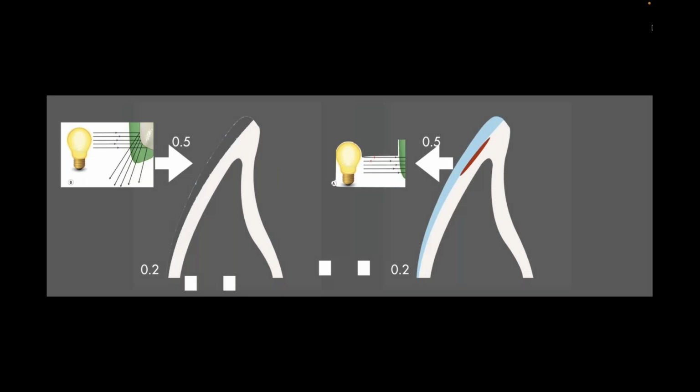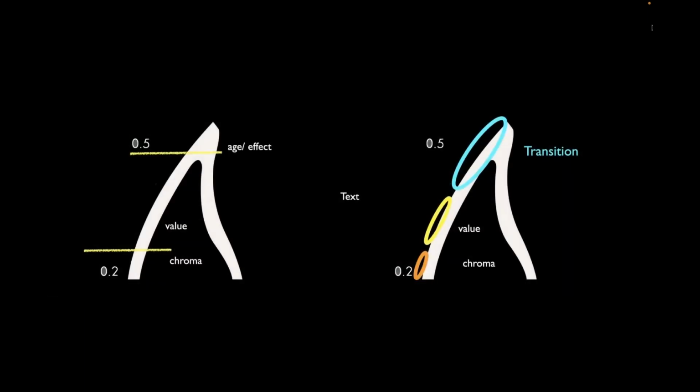So if I'm using something very translucent on my facial 0.2 to 0.5, a lot of that light is going straight through the enamel and hitting what's behind it. What's behind it may be a natural tooth, it may be your micro-layered crown, or it may be your fully built crown. I don't know, but I do know that I'm going to get a lot of that light transmission through it. If I use something with more opacity or more white or brightness to it in my enamel, then I'm not going to get as much of the light going through. I'm going to get more reflection from the surface. So I kind of want to think of that concept as I'm working through my case.